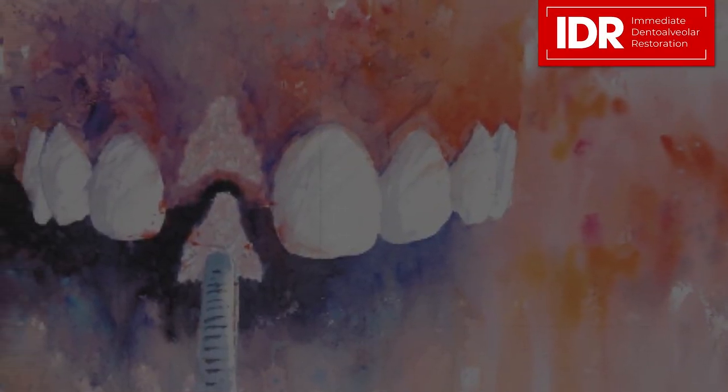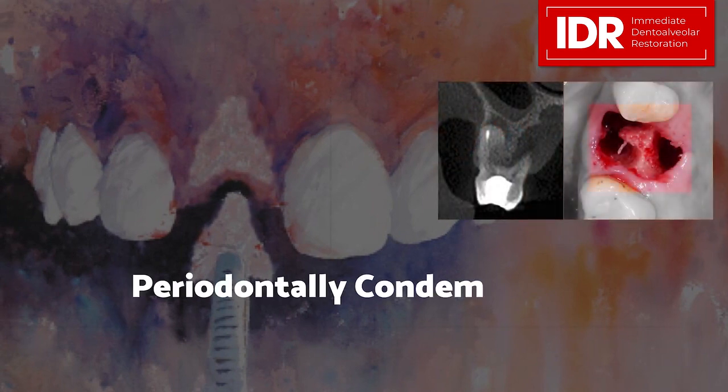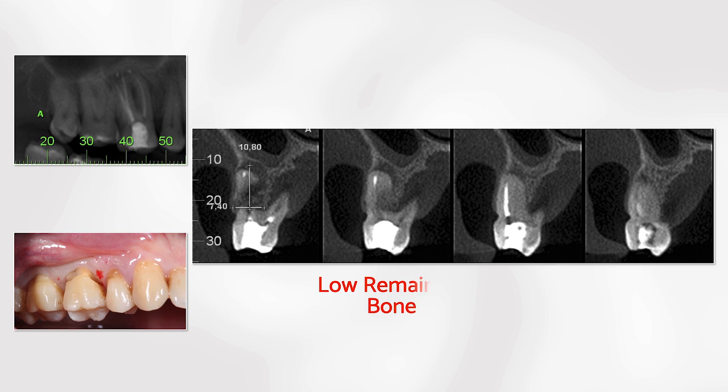To finish this module, I would like to share with you a case that presented a periodontally compromised tooth and severe bone loss, and how we managed that. Here we have the first molar condemned to be extracted. This is a periodontally compromised tooth. And here the CT scan of this condemned tooth. We have only a low remaining bone at the interdental septum.